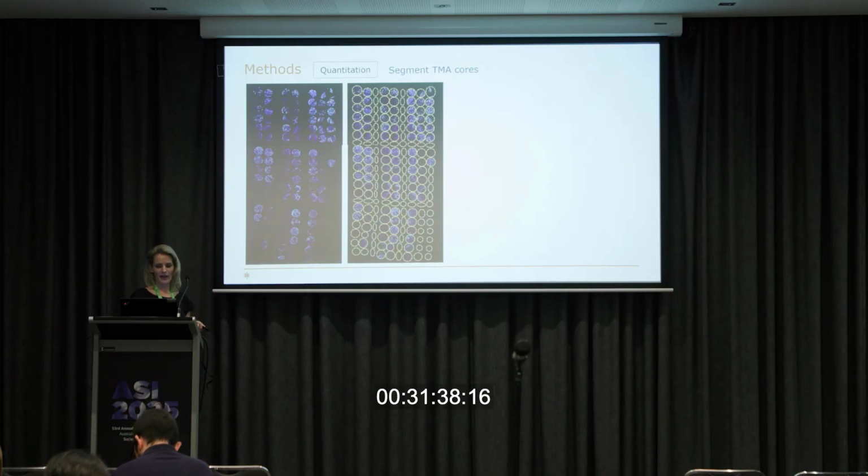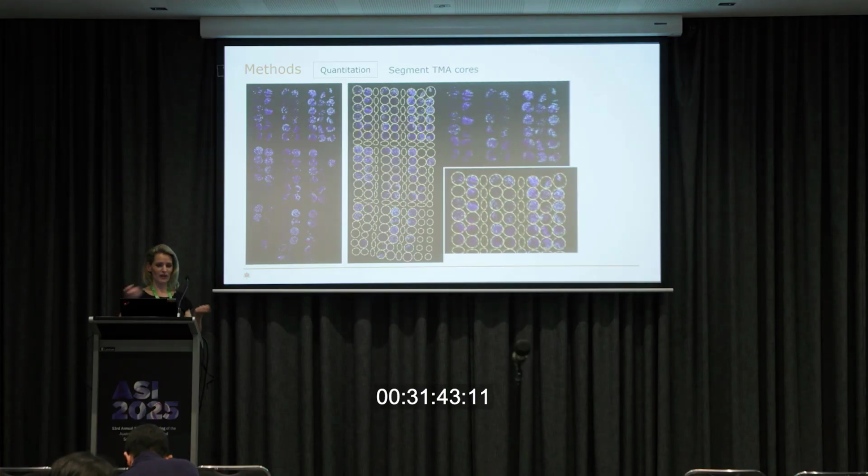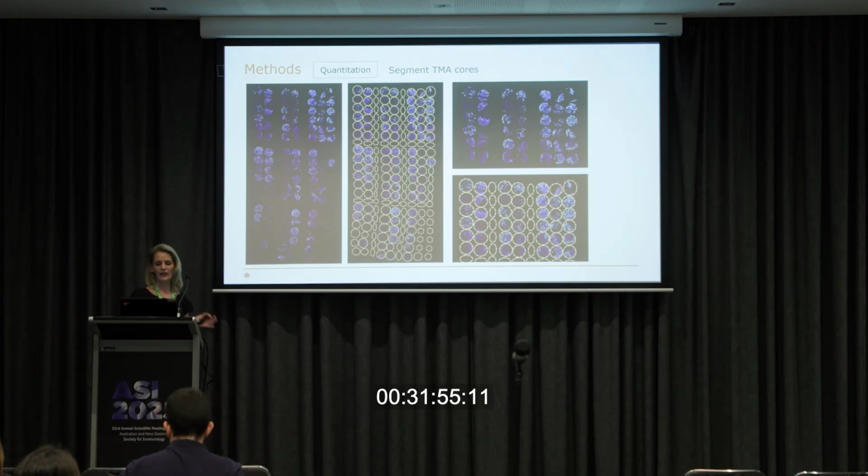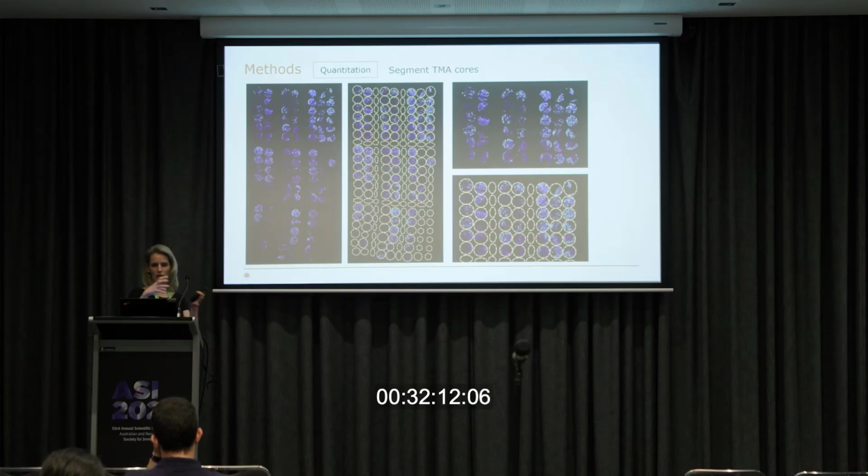The tissue microarray segmentation is very easy. It has an auto-detect, so if you just want it to find the tissue for you, it can. We tend to still create a grid because we have an Excel spreadsheet with our TMA map in it, and if we have every core that could possibly be on there, then when we export it, we can overlay those really easily. You can see also our TMA is asymmetric, which helps us orient it depending on how it gets cut onto the slide. And once these spots are created, you can change the size of individual regions and you can move them around.